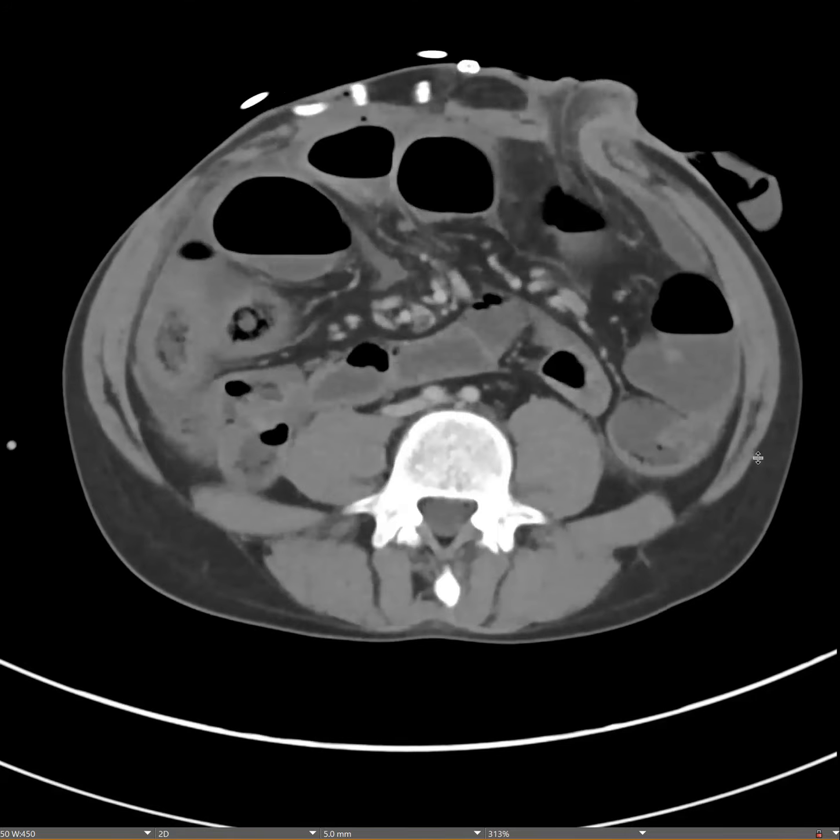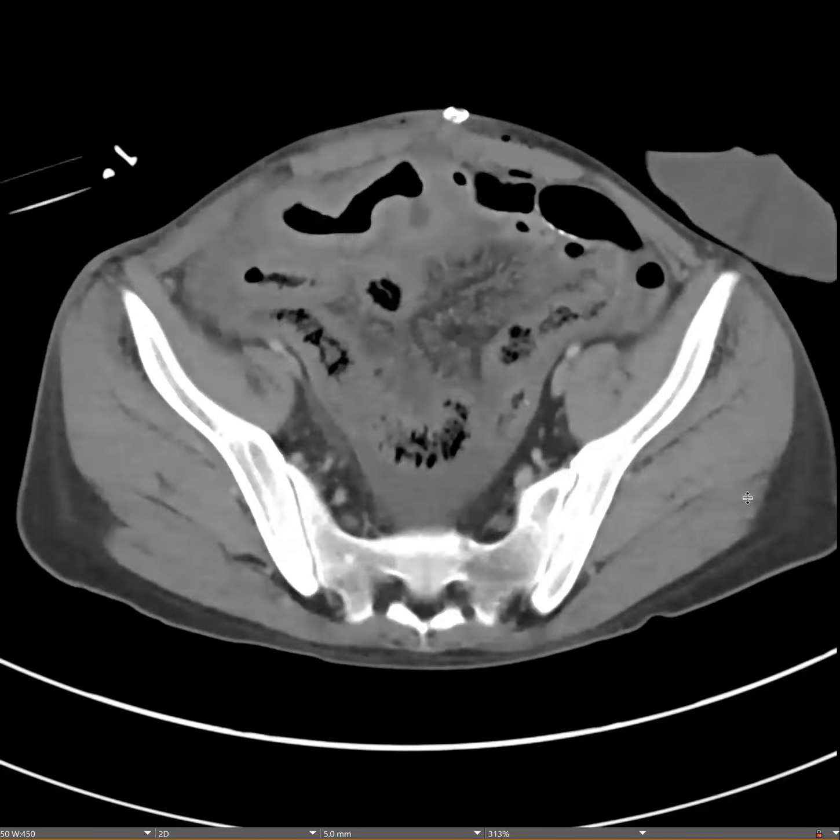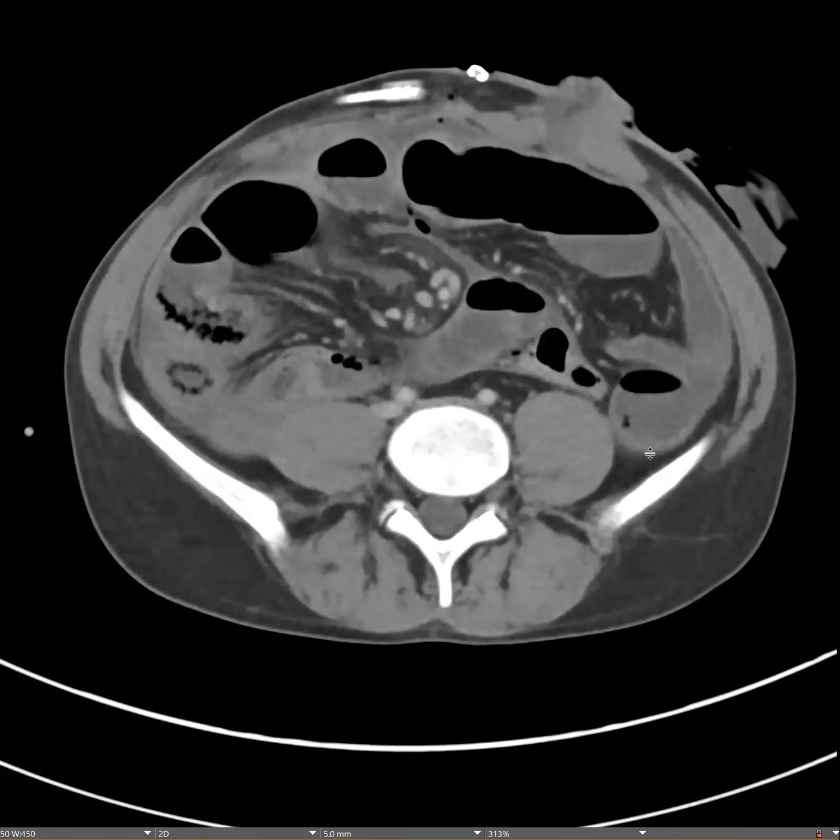Wow. And then the dilation of the bowel, is that just from chronic disease? Yeah, from his Crohn's, and I think he has a transient dilation. We don't see an acute transition point. Then it resolves. I asked the surgeon, and not once did they find something. He even has gas in the veins, and he said, yeah, we never found anything, multiple times. We want to know if it's worse than his worst-ever CT, and if it is the same or less than that, we're not taking him to the OR. So that's what he said. I was like, wow.